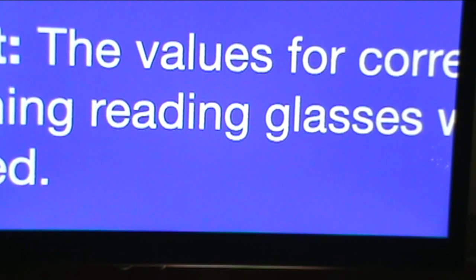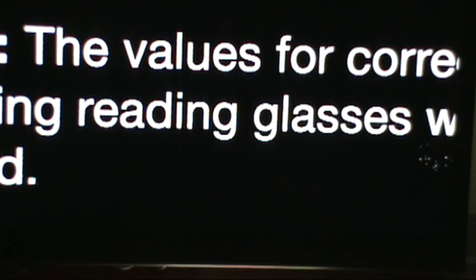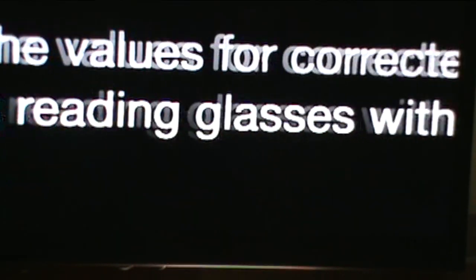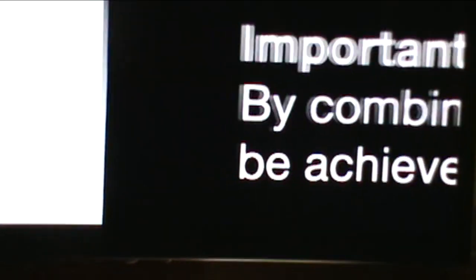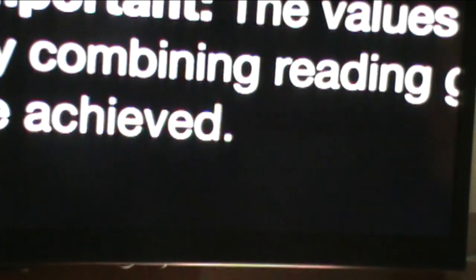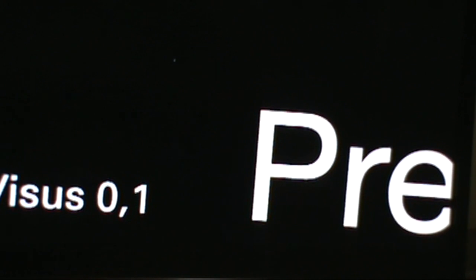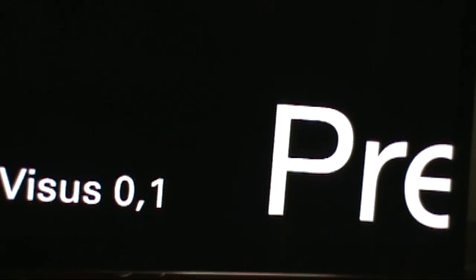Okay, let's shift back to the text here on the black background with white text, which is really cool because, again, we can still demonstrate how quickly and rapidly we can read with minimal or no tearing at all or blurring of the text. Good quality machines should not have this problem. Okay, so that's a good selection here. Let's just say our eyes are tired. Let's look at text in a different way.